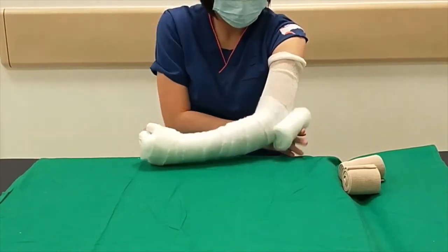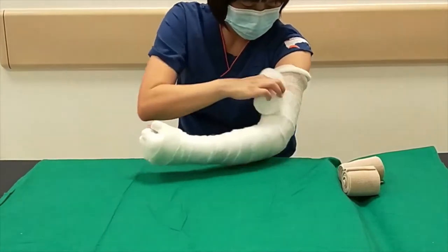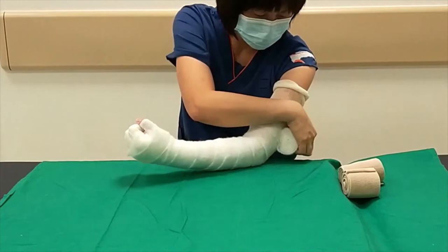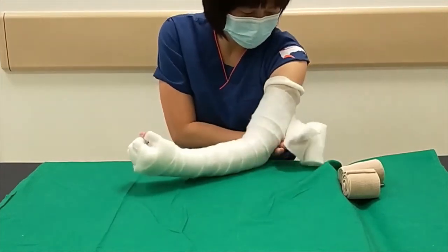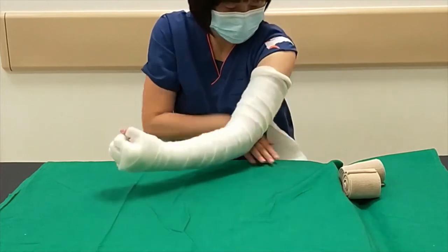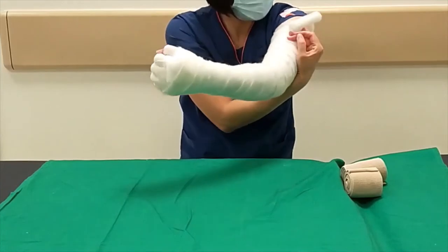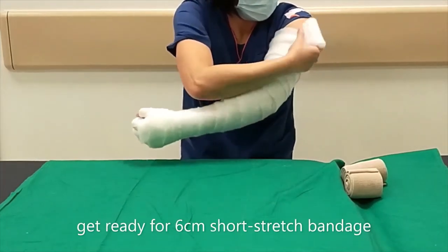The rest of the cotton is used up the arm. The elbow should be flexed from 30 to 40 degrees, and the cotton continues up to the axilla. Spread the fingers.